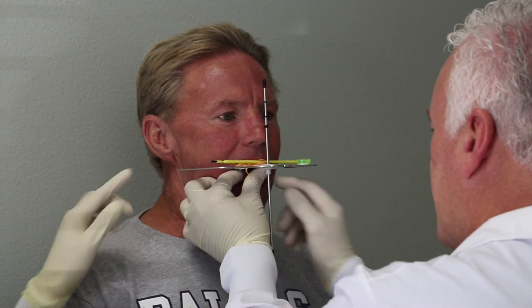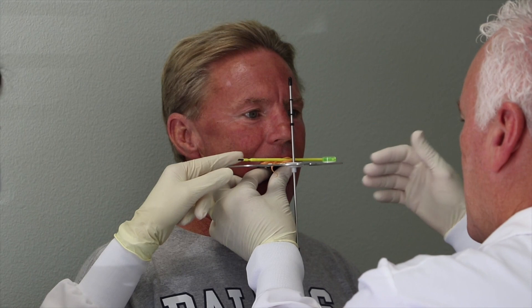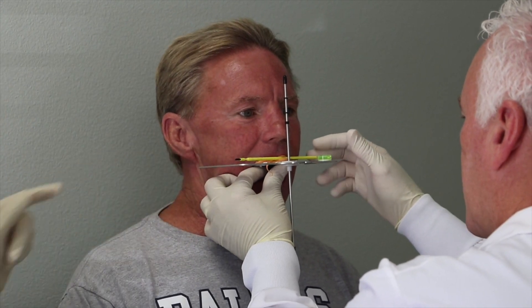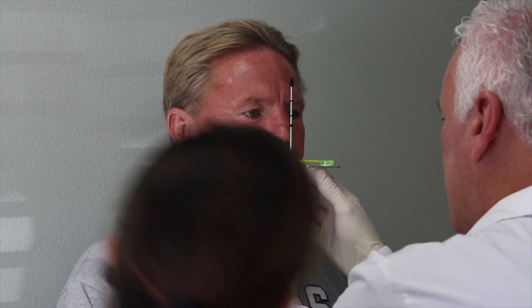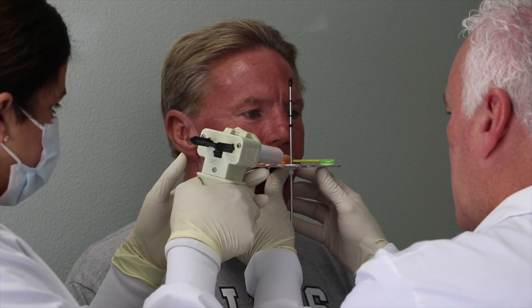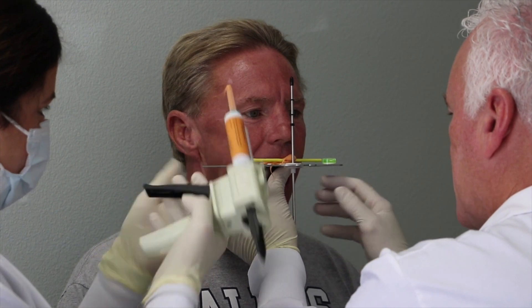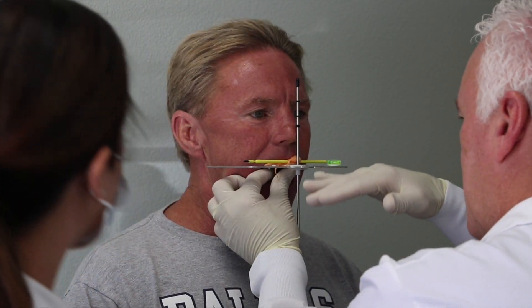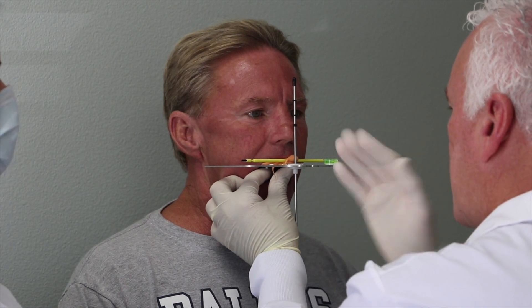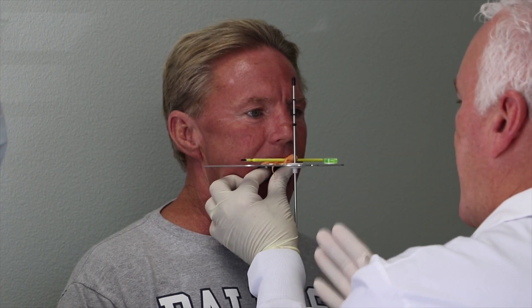And it is — it looks great. Steph is making sure that we are parallel from that angle, and I've got a little bubble on top here. Turn to your right a little bit for me — right there. I'm trying to get that bubble right in the middle, and it is. We are now straight up and down with his nose, straight up and down, and parallel with his eyes. So I know these are going to be mounted where the lab can now build them straight.